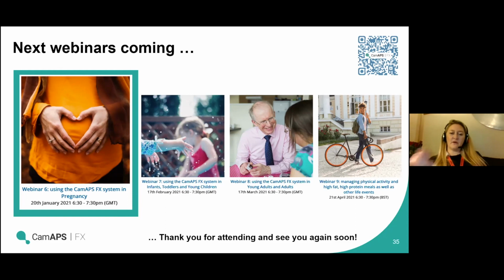It's more about, so the reason compatibility is an issue is purely about the Bluetooth drivers. So quite often if people have got the app on a phone that's not technically compatible, it will still work in a lot of cases, but what will happen is we'll get people contacting us saying they're getting awful problems with connectivity of the sensors and it dropping out all the time, and then when you drill down and say, hang on, are you on a compatible phone? Yes. And then when we ask people to submit logs and we can see what the phone is, it's not just the phone, but it's also the Android 9, 10, 11, the Android system running on the phone.